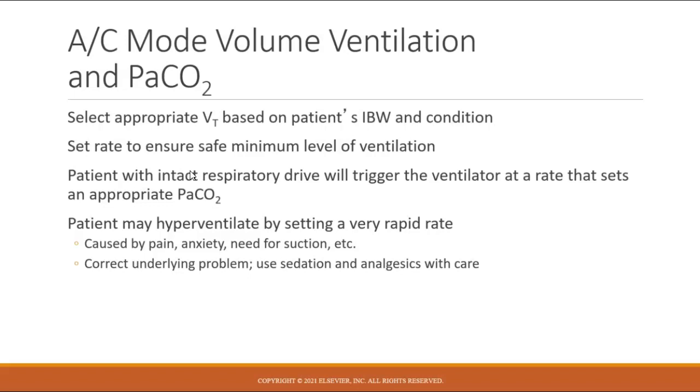Like the solution to troubleshooting your patient, your first answer should never be just go get the Versed and knock this guy out. It should be, let me look at all the other things, make sure that my vent is synchronous and interacting with my patient appropriately, make sure that my patient doesn't have any other underlying pain or anxiety that's causing them to be tachypneic. Sometimes patients with fevers can end up being very tachypneic. Do those things first before just resorting to asking for increased sedation.